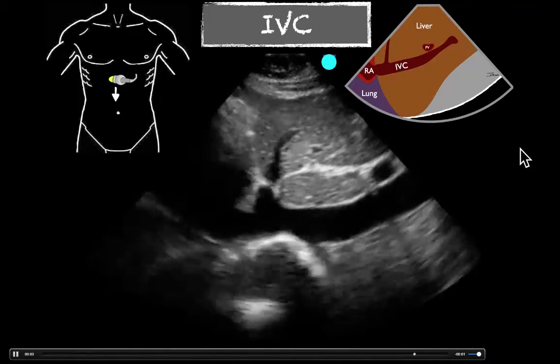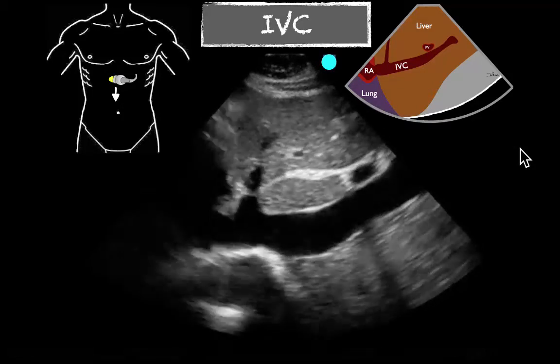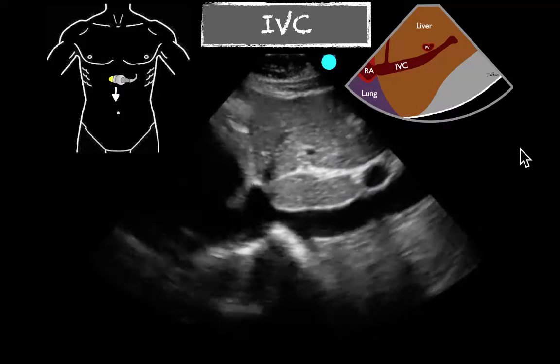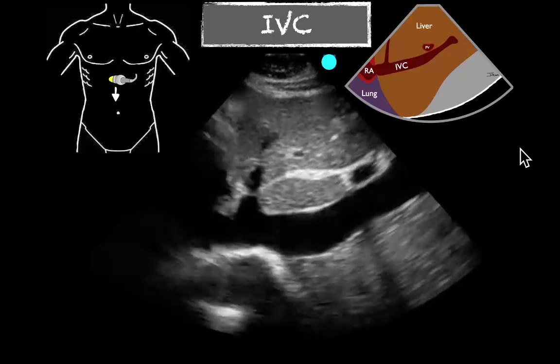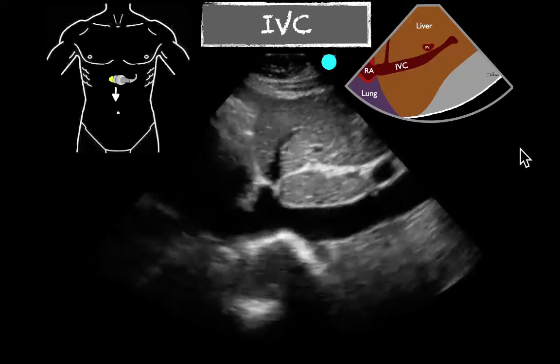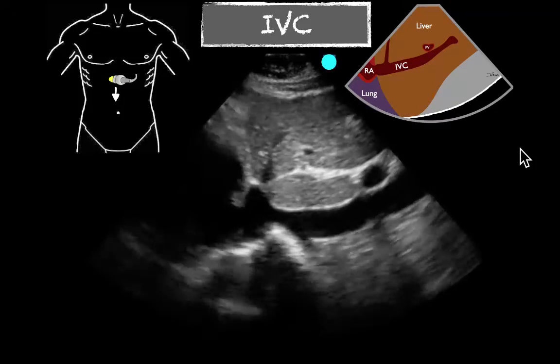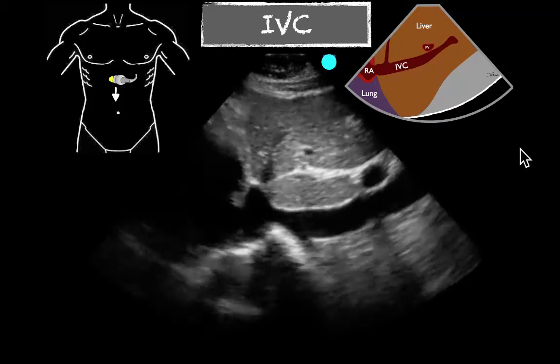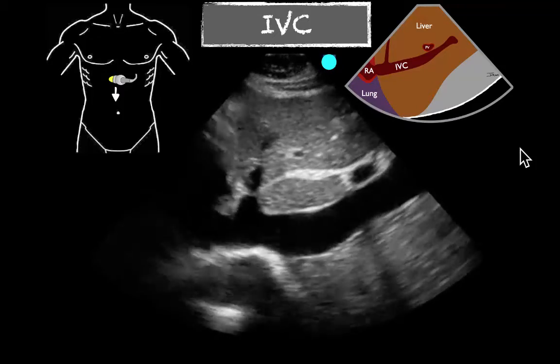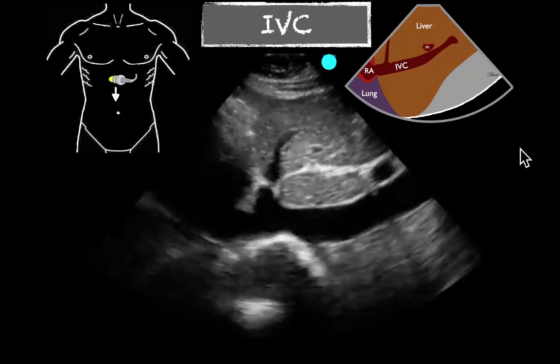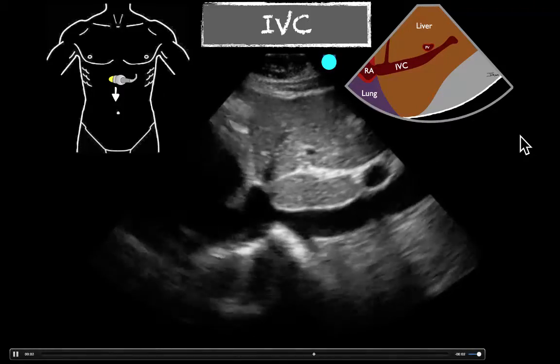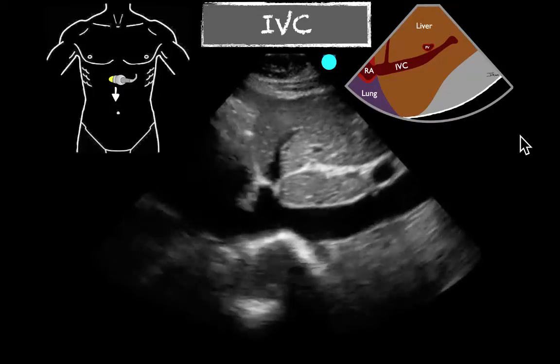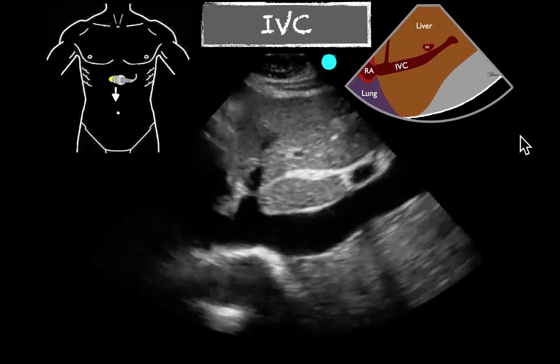If you want, you can put M-mode on there. You could freeze it and try to get the measurements to be exact, and that would be good if you're doing an IVC collapsibility index. But for the most part, I just like to eyeball it, and I do like to save clips of it just so that whoever is following up — a consultant or any physician at a later time — can look at this also. So hopefully that's helpful. These are some normal variations here with essentially normal CVPs. Hopefully that's helpful to you. Thanks.